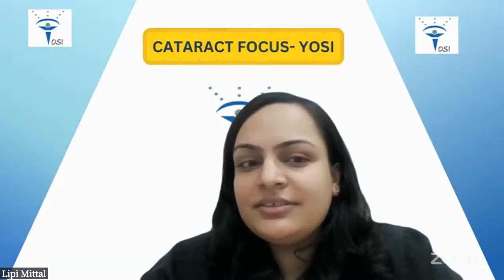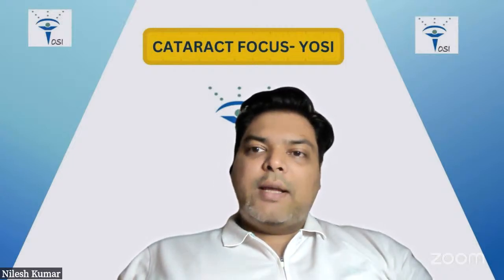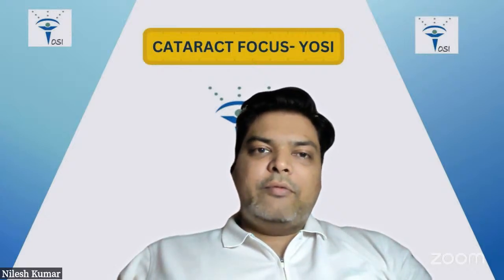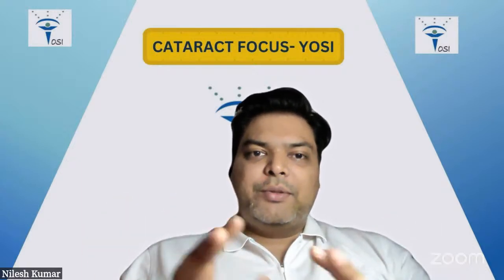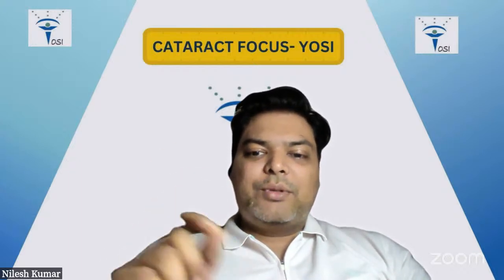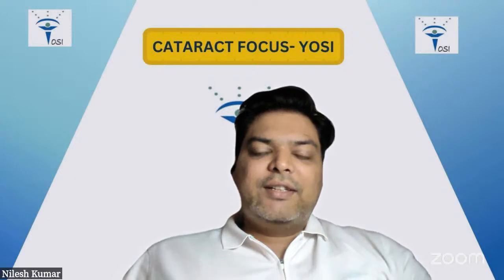Nilesh sir. I think everything has been covered very well. Bhavya sir has covered it quite nicely. The Oro Lab has come up with a stamp also for SICS tunnel. So those who are in the beginning, they can get that stamp to practice. But please don't get too dependent on that, because you need to develop your estimation. That is just to guide you for the initial 5-10 cases if you are very hesitant. Rest everything, Deepak sir's comments are already there for details.